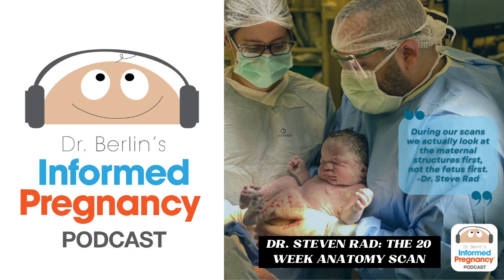So for patients who have a poor pregnancy history, or a previous child with an abnormality, or a family history of some genetic issue, or who have taken a long time to get pregnant, whether they're having recurrent losses or an IVF journey, or just someone who wants early scans and the best care early on, those folks may opt to do an early anatomy ultrasound.